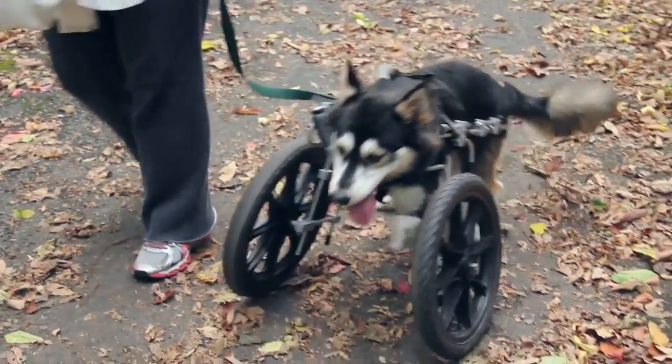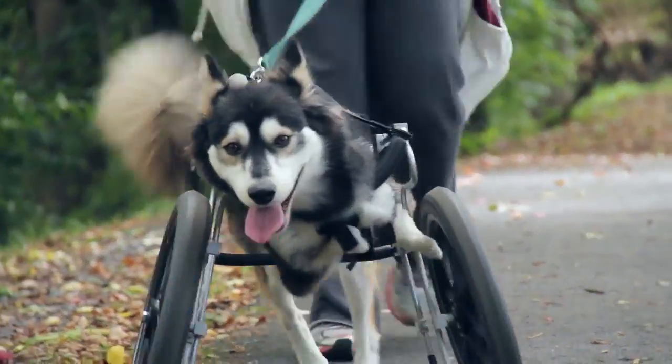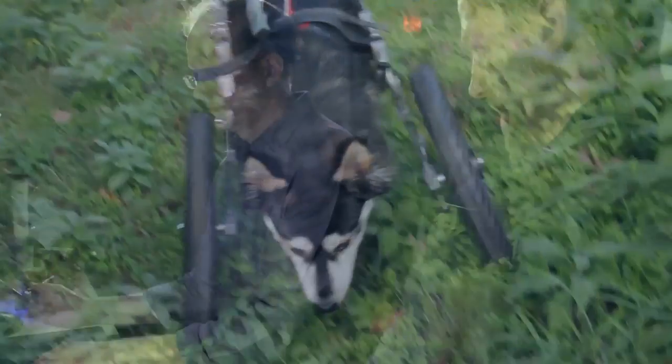We decided to get him a cart, which worked quite well, but it limits his mobility in terms of being able to play with other dogs, and it's not really the full motion of running.